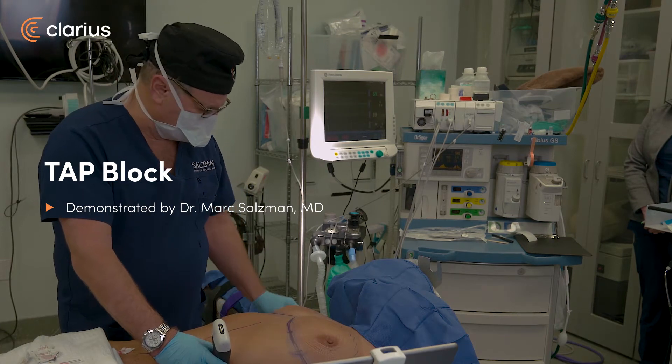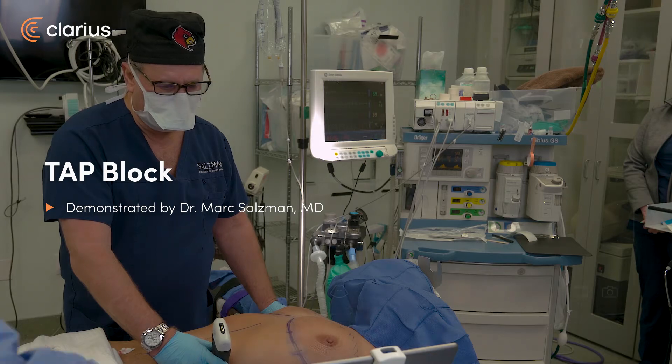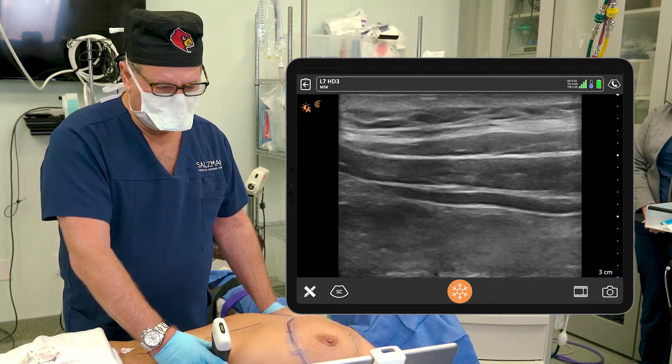We're going to do a TAP block since this patient is having a mommy makeover consisting of breast augmentation with a silicone gel implant and an abdominoplasty.